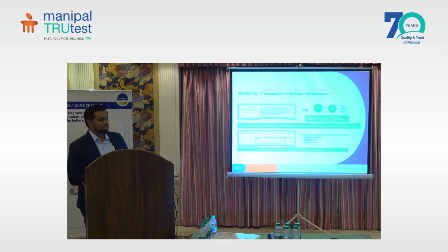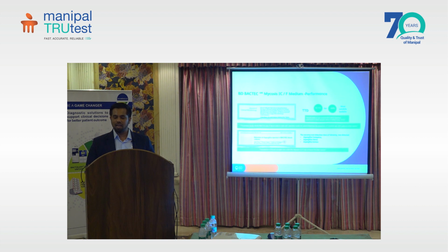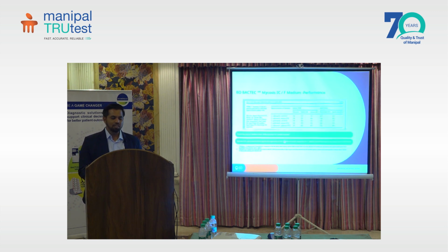Studies have mentioned that almost 80% of Candida species, including Candida glabrata, and other organisms like Cryptococcus neoformans and Saccharomyces were recovered within 16 hours, which is quite significant as compared to other media, when we consider aerobic media and others. Other organisms like Aspergillus were also significantly recovered in this media.